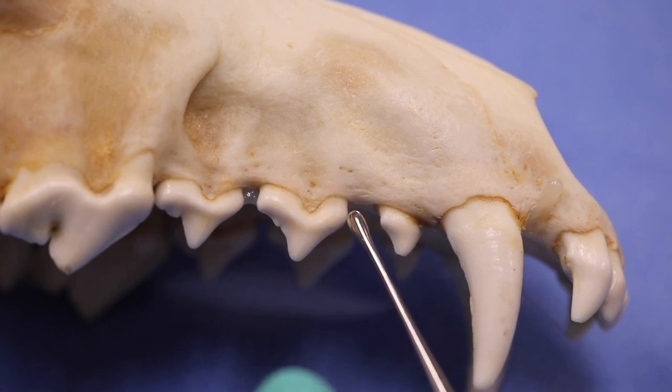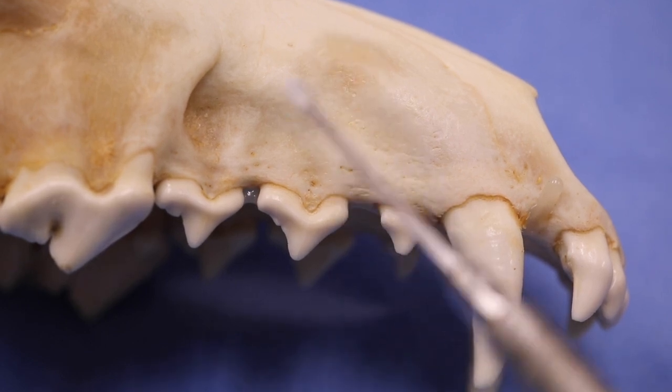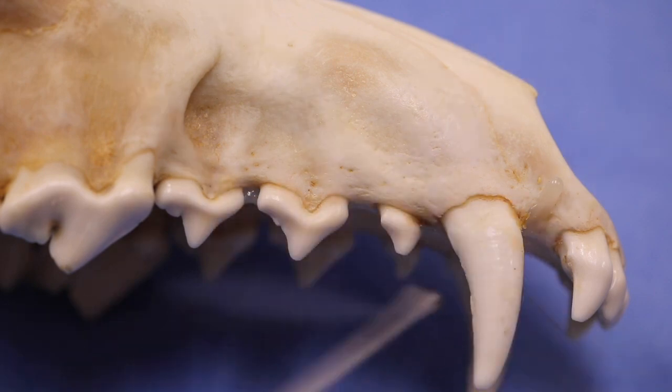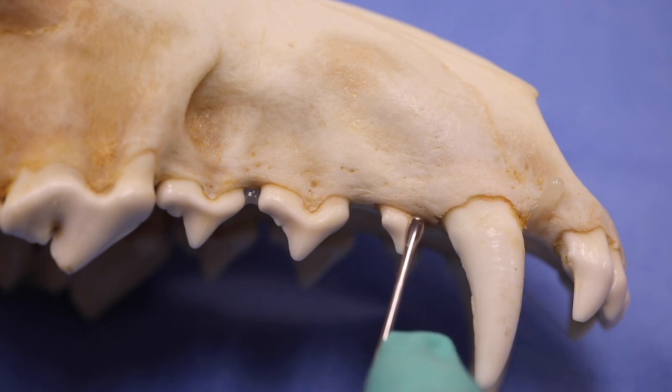the chrome-like finish towards you. Looking at it from the other side, this is more of a milled look, and that is the side that actually goes toward the patient. So when we use this, we want it to be at this orientation.